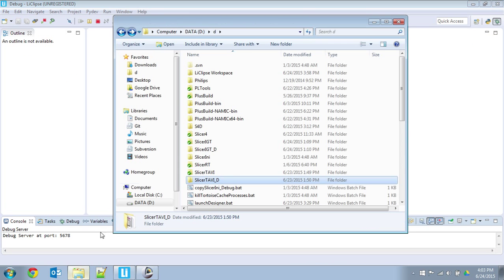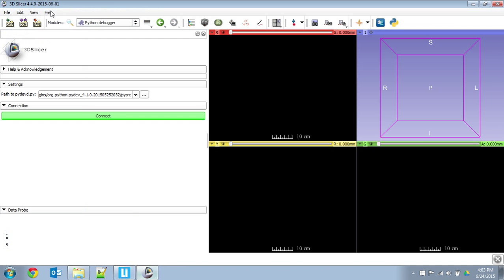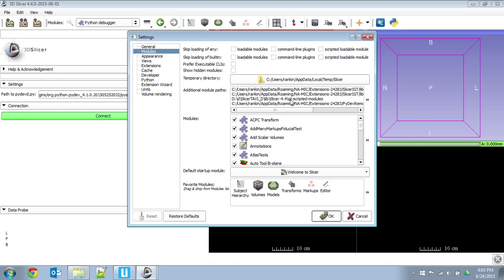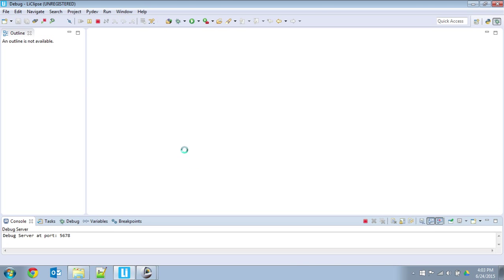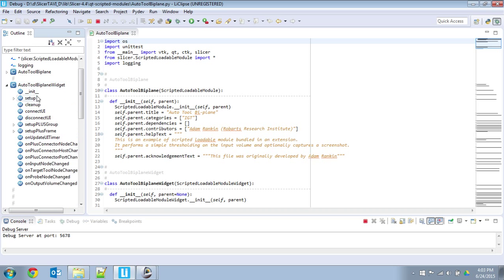So now I'm going to load my demo files, and you'll notice that I chose the directory in my Slicer modules location. So I'm going to go to this path here and load. Let's work with Auto Tool Biplane. Great. So here I've gotten used to LiClipse. I quite like it. You can browse methods pretty quickly.